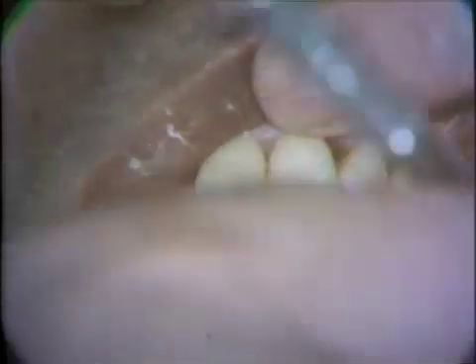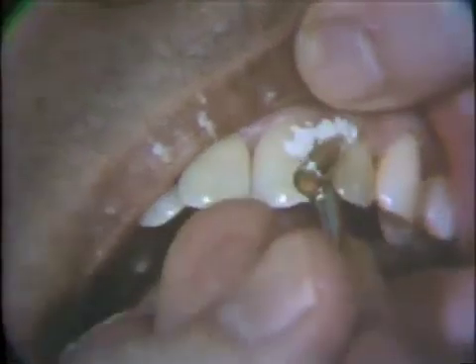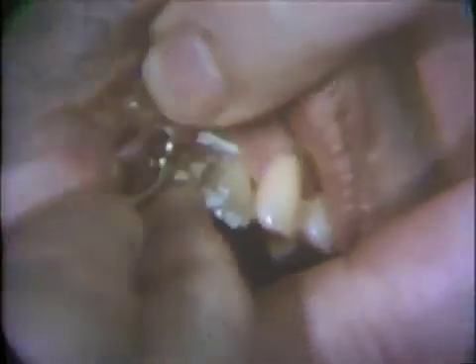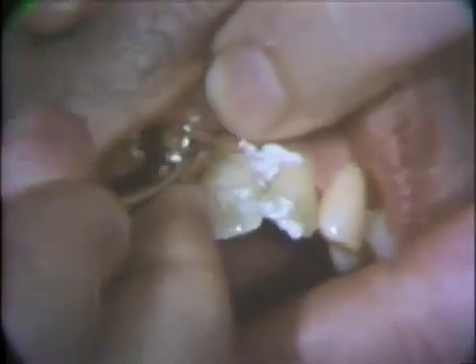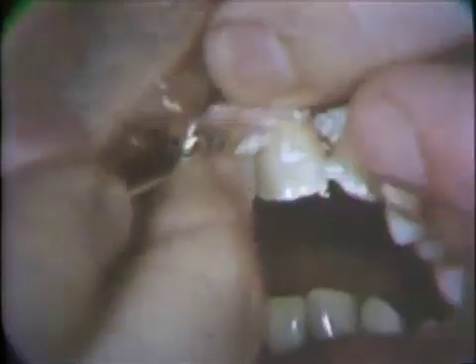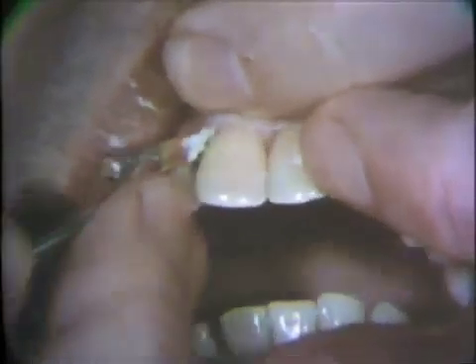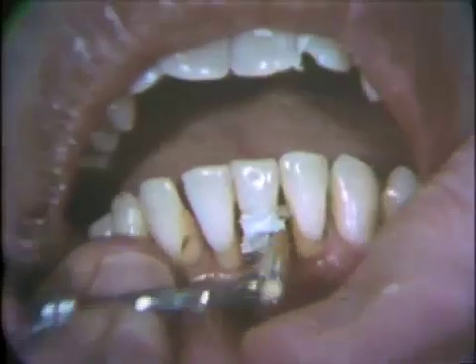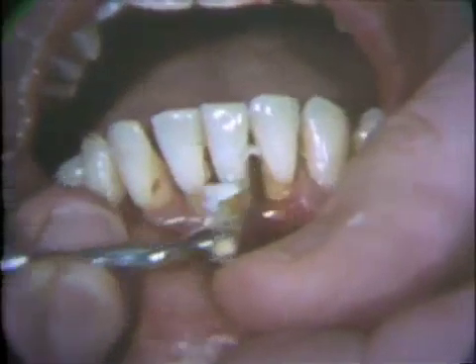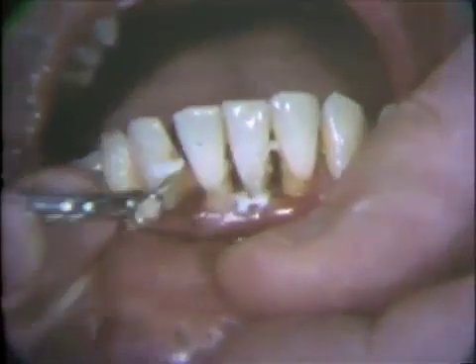An orange wood stick or port polisher can be used interproximally and for the cementoenamel junction. Polishing paste is first placed on the teeth. Then the polisher is moved up and down and extended into the gingival crevice as deep as possible without causing discomfort. The open spaces between the lower incisors provide excellent access for the port polisher. Notice the position of the fingers and the firm burnishing type of action that is used.